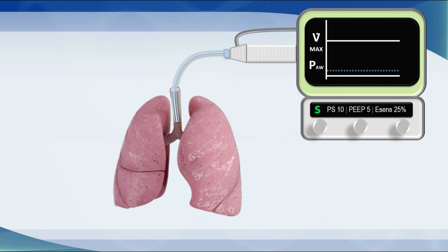The Y is the connector of the breathing circuit to the endotracheal tube, and the gas is flowing in inspiration. This generates a nice positive pressure waveform on the screen and a nice flow waveform as well. And these are quite conventional looking, a positive pressure waveform, positive and then negative flow waveform.